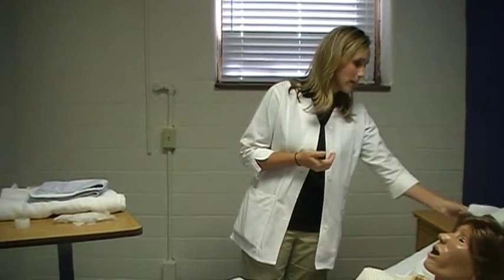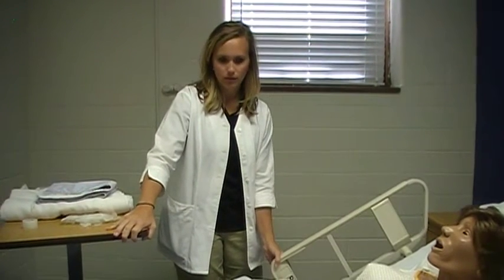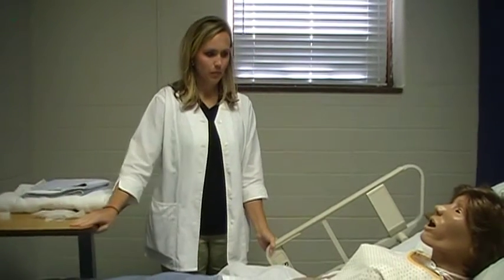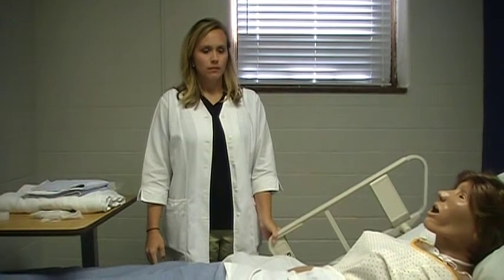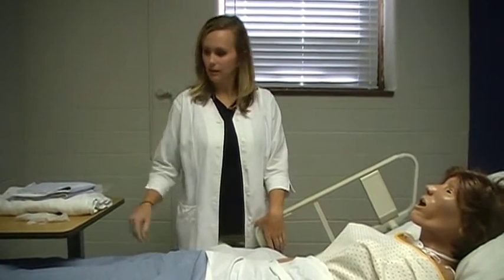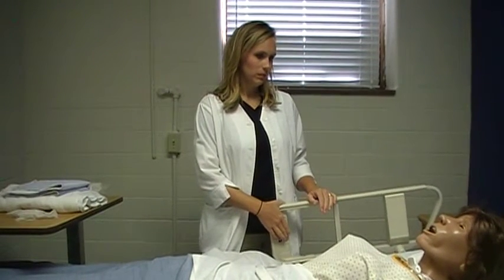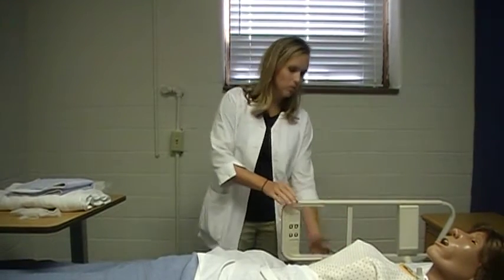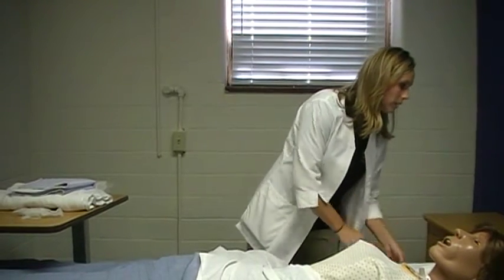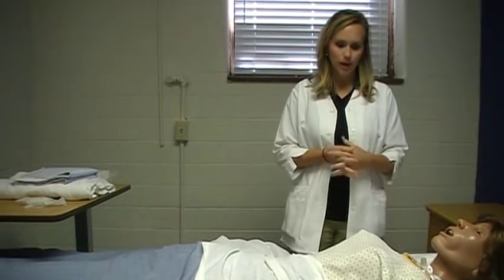In order to get our bed up, we raise our side rails — just the one on my side so I don't block the view. We're going to raise the bed to a good working level, then lower the patient's head so she is in supine position. We'll lower the rail on the side we're working, then arrange supplies and equipment on the table, ensuring good lighting.